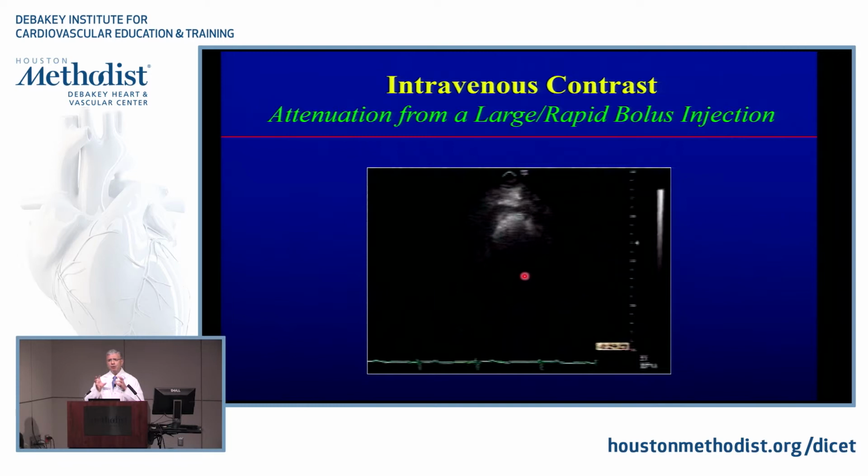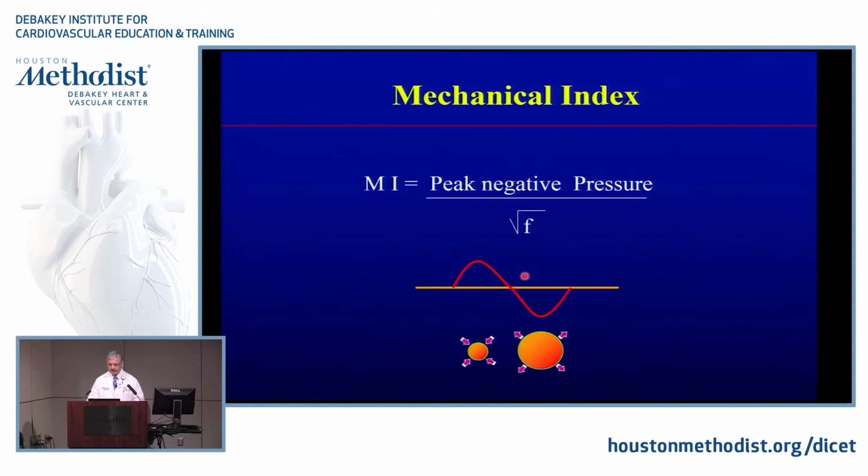That's why we dilute it, and that's why you inject it over, like, 3 seconds or 4 seconds or whatever it is, slow. So it mixes with the blood that's going on and with the saline infusion. Now, I mentioned to you that we have to understand the energy that is transmitted from ultrasound because these microbubbles are fragile. They are fragile.